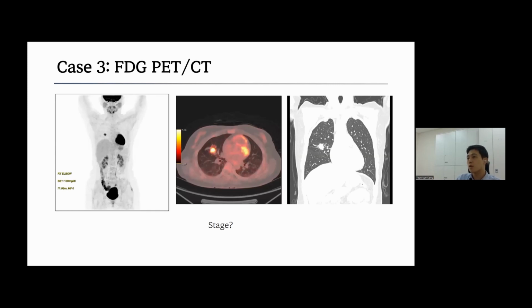And what's the stage? Tumor diameter is about 2 centimeters. And is the stage T1b?